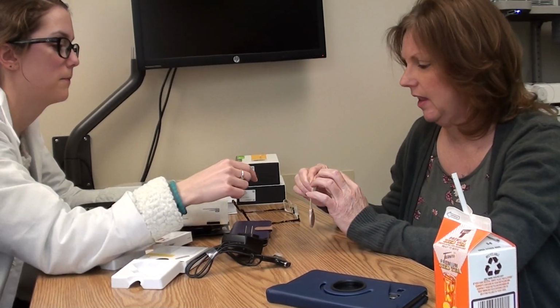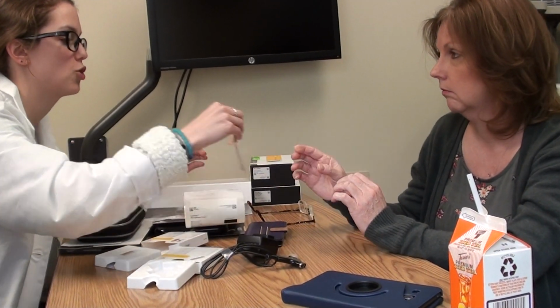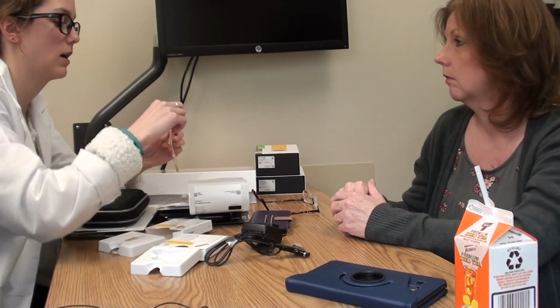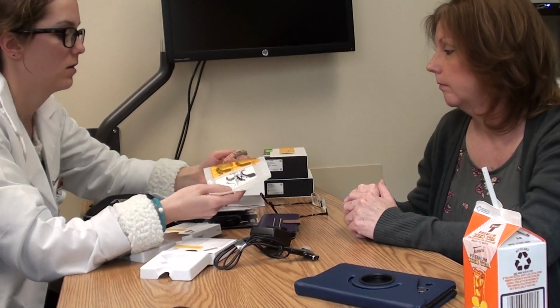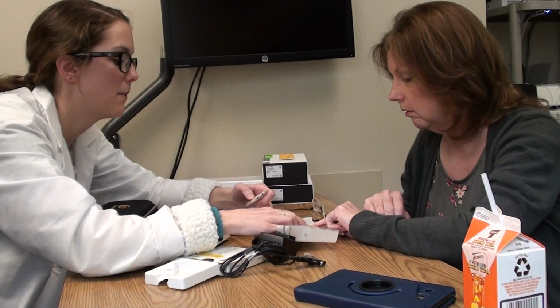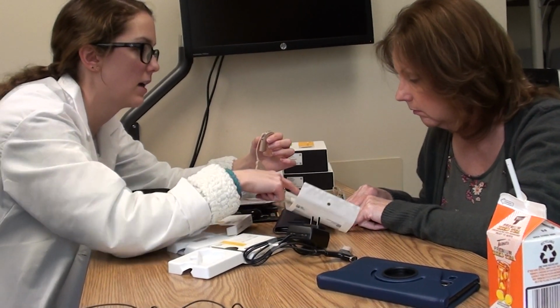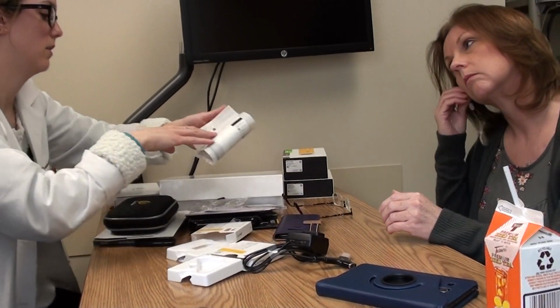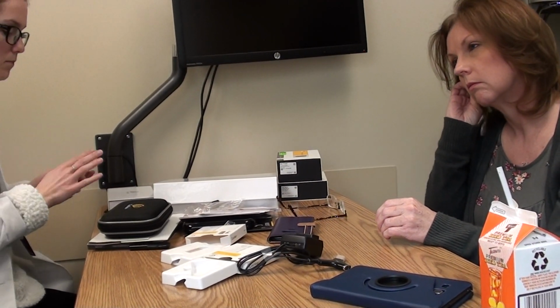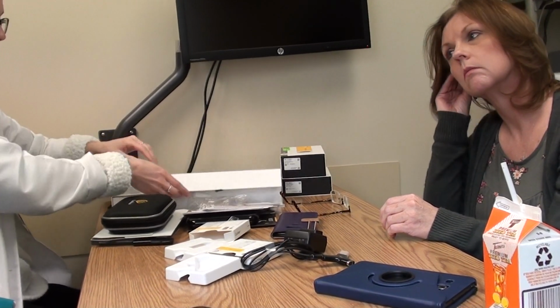So you pull, that pulls out? It pulls straight out, okay, and then this whole piece pops off. Two of them in there. Yep, and there's instructions here if you forget. Okay. Go ahead and put that back in. If you want, you'll see me in 6 months. I can just do it for you, just bring them.